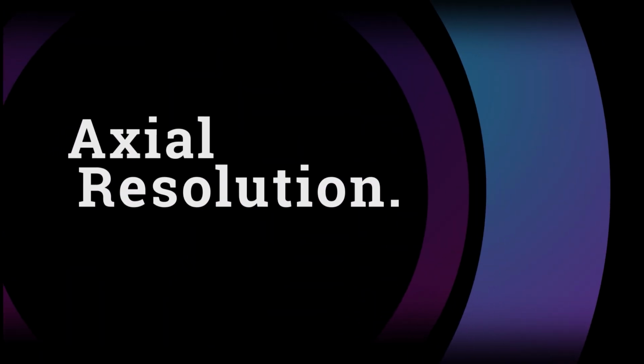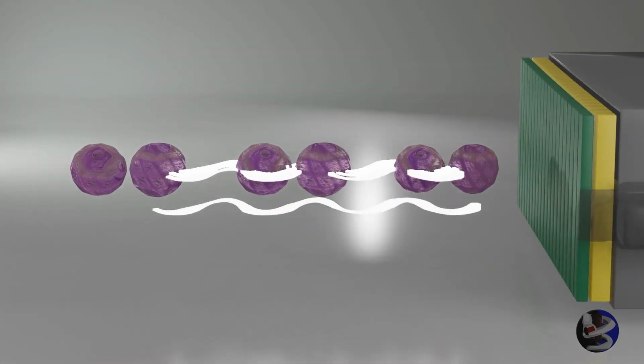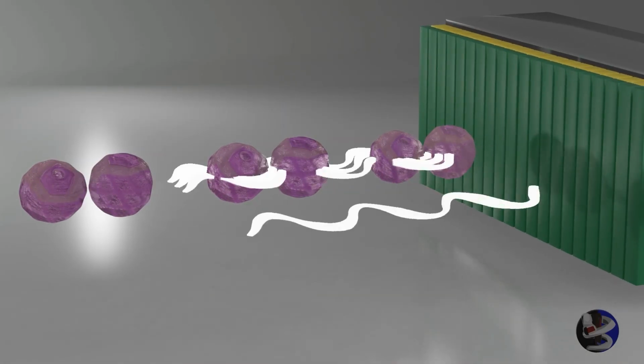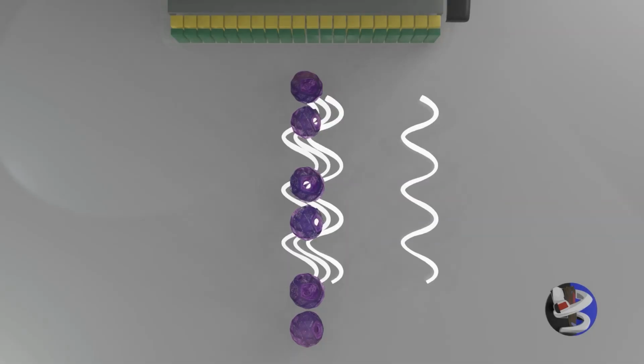Axial resolution is the ability to distinguish two separate reflective objects that are longitudinally adjacent or slightly deeper than the other along the ultrasound beam. Imagine the following example. There are three pairs of reflective objects, and each is right next to the other, but slightly deeper than the other. These three pairs of objects are located at different depths embedded in tissue: shallow, deep, and very deep. An ultrasound beam will go through them, and they reflect these pulses back.